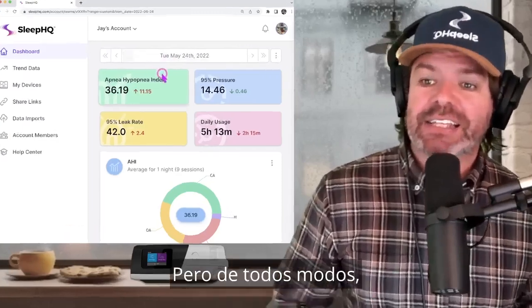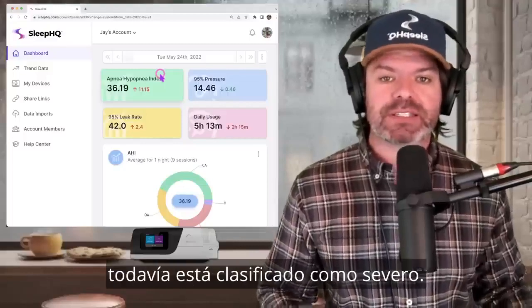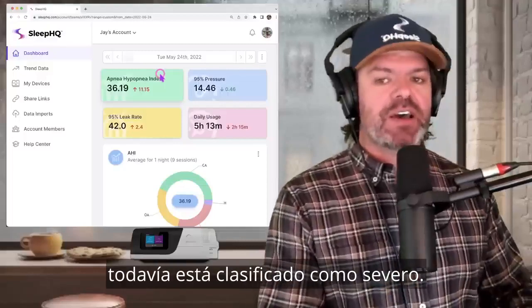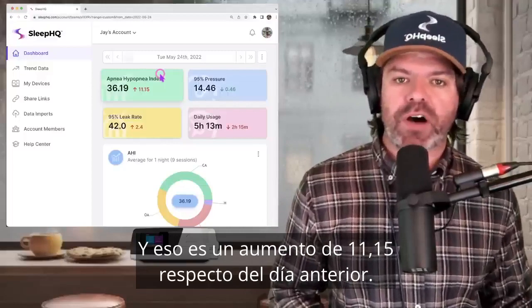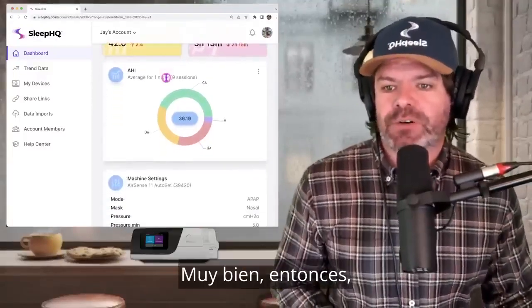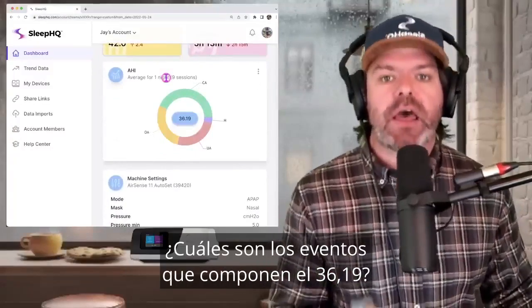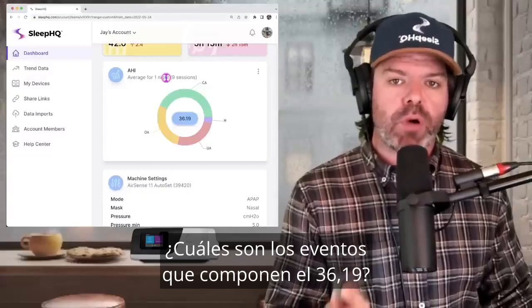But anyway, his apnea-hypopnea index is 36.19. So even with therapy, he's still classified as severe, and that's up 11.15 from the previous day. Let's scroll down and check out the donut. All right, so what's his apnea-hypopnea index comprised of? What are the events that make up the 36.19?